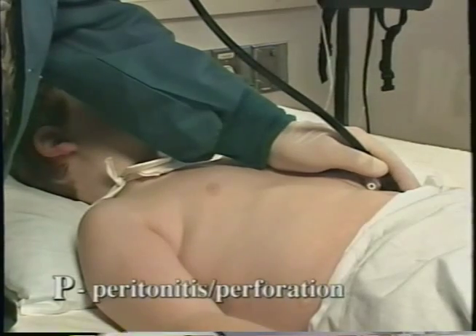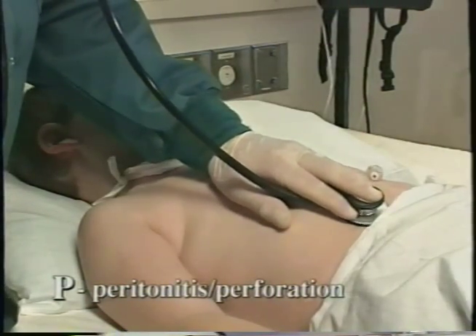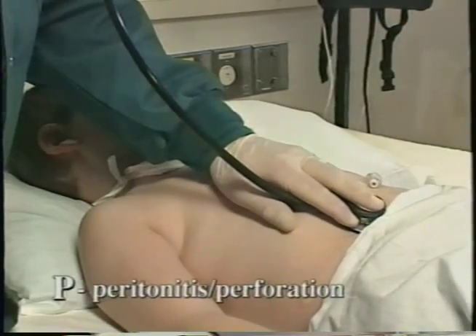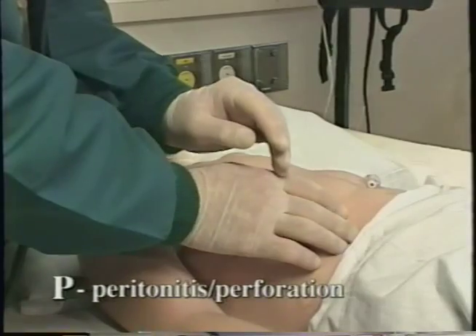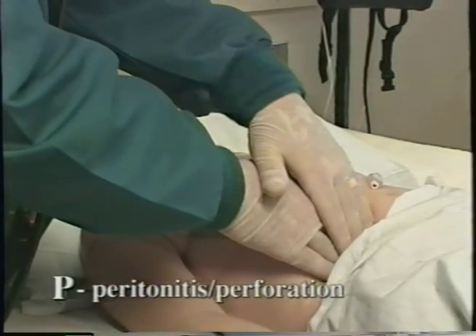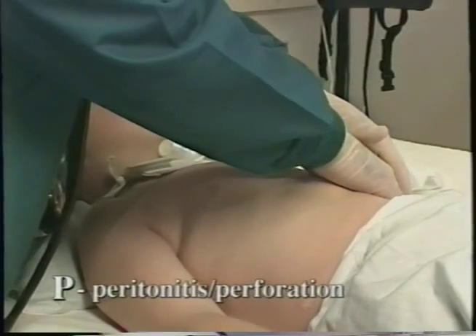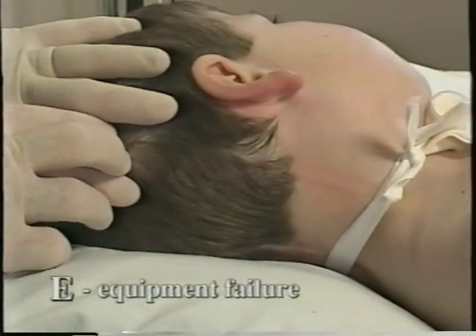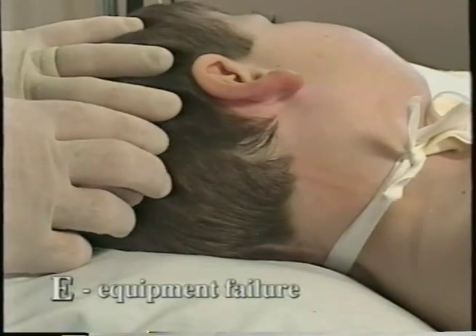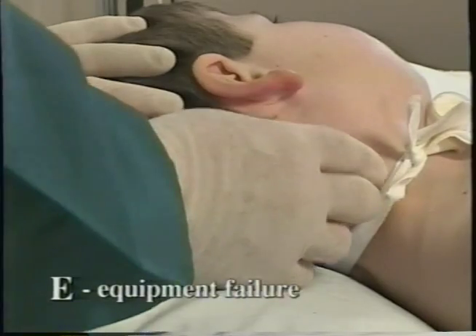P is for peritonitis or perforation. CSF shunt catheter infection may lead to peritonitis without disturbance of bowel integrity. Alternatively, the shunt may erode or perforate the bowel. Are there signs of peritoneal irritation or free air? And finally, E is for equipment failure. Are there any leaks, cracks, or fractures in the shunt or its connections?